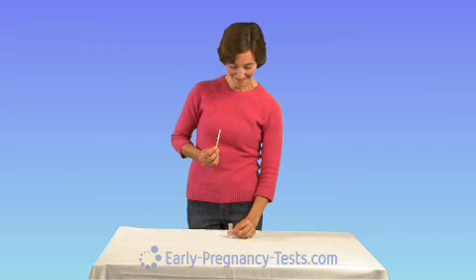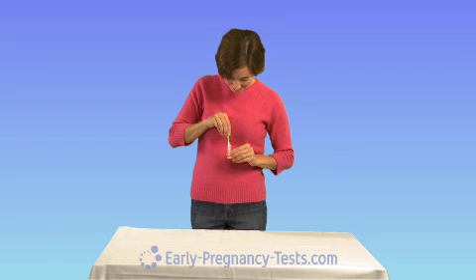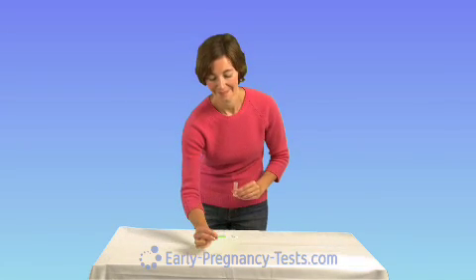Now, dip the test in the collected urine sample, being careful not to go past the max line on the test. For demonstration purposes, we're using a laboratory urine vial, but you can use any clean container in your home — a Dixie cup works fine.